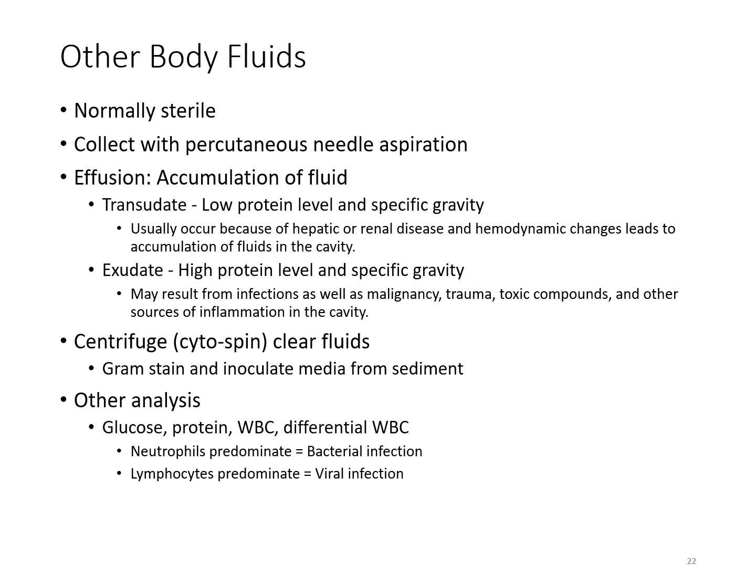that's going to lead to the accumulation of that fluid within that cavity, or an exudate where you have a high protein level and a high specific gravity, and this is going to be a result of an infection, or could be a malignancy, trauma, some sort of toxic compound, or something else that has caused some sort of inflammatory process to take place within that cavity. These specimens will require some sort of centrifugation in order to create that sediment that you will gram stain and use to inoculate your media.